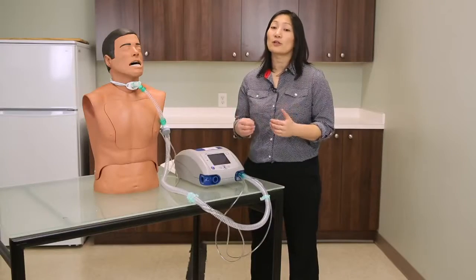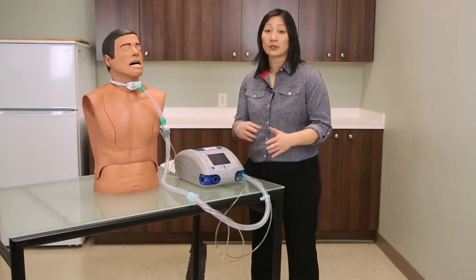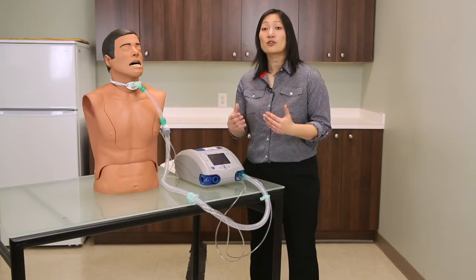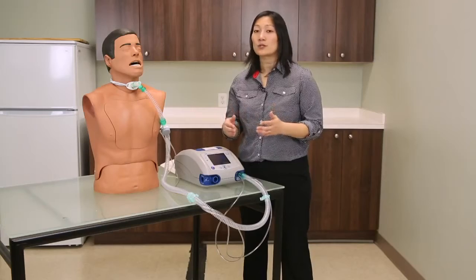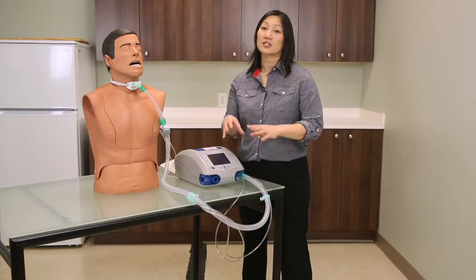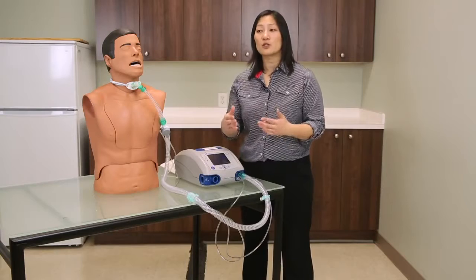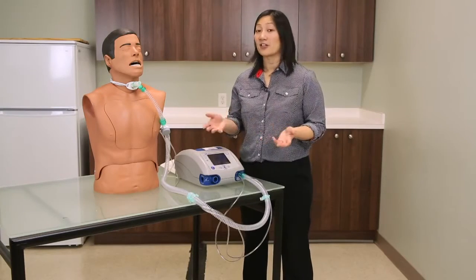When setting your low pressure alarm, you want to set it as close to but above the back pressure measured in the circuit. The closer you can set it to your normal operating pressures, the safer it is for the client. However, if your client's normal operating pressures fluctuate a lot, you may get a lot of nuisance alarms. What you want to do is set the low pressure alarm above the back pressure that's generated in the circuit, but close enough to your normal operating pressures that you're not getting nuisance alarms on the ventilator.